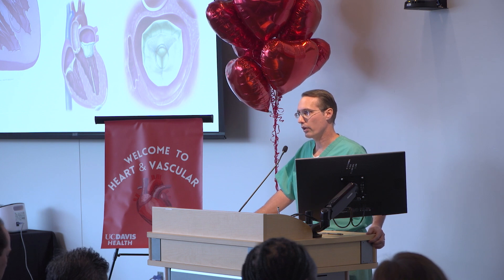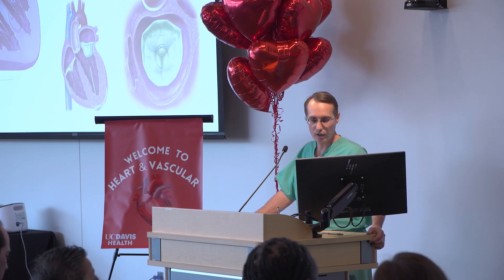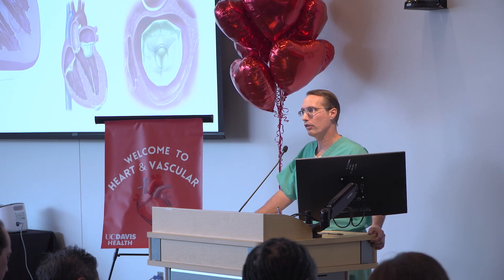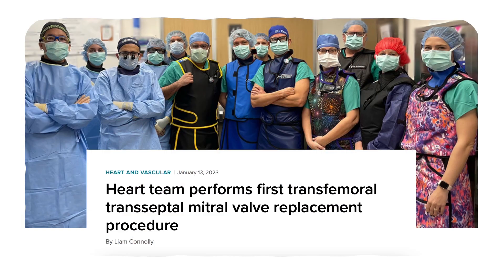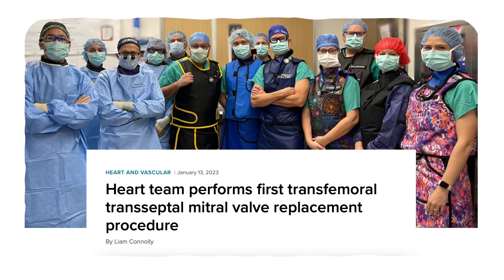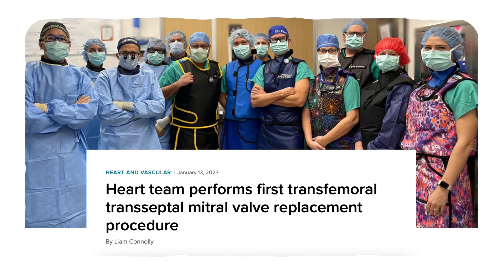Patients don't have to undergo traditional open heart surgery. I'll show you the team that just did the first transcatheter valve replacements for the mitral valve — some going through the interatrial septum, some through the apex of the heart. Both techniques are under clinical research ongoing here right now to actually replace these valves without traditional heart surgery. The techniques are getting easier and will be more defined in the future. That was the first transfemoral transseptal mitral valve procedure on the west coast — you can see Dr. Kiai, Dr. Singh, Dr. Rogers, and the team there.